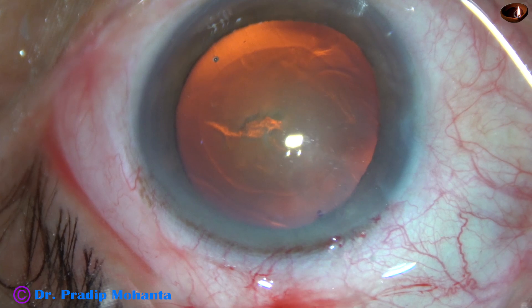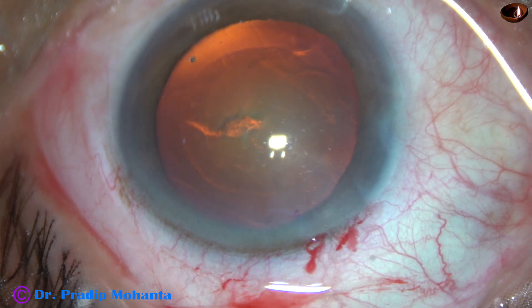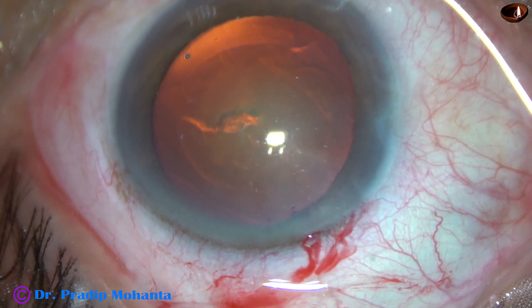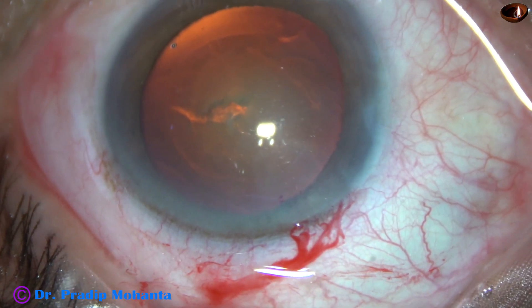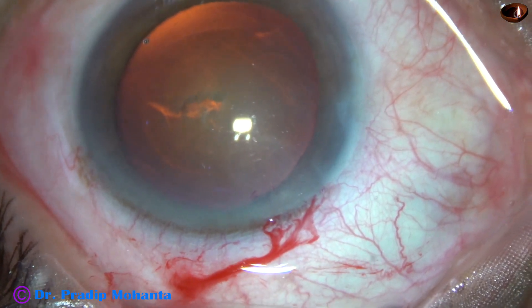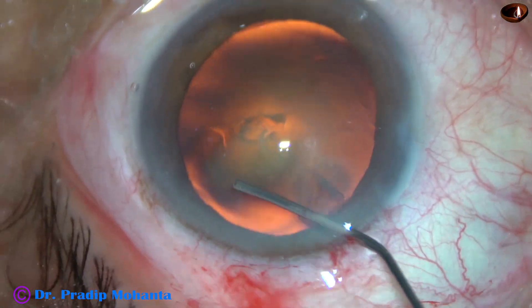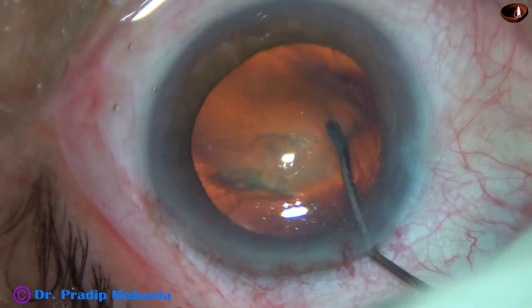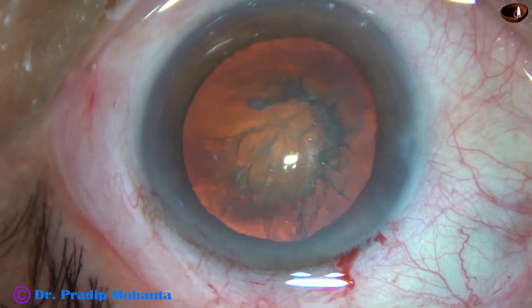The size of this rhexis is about 5.5 mm. Now hydrodissection is done. A 27-gauge cannula is attached to a 2 cc syringe with BSS, and the cannula goes just underneath the anterior capsular rim. The fluid is injected, and see — the nucleus rotates very nicely.